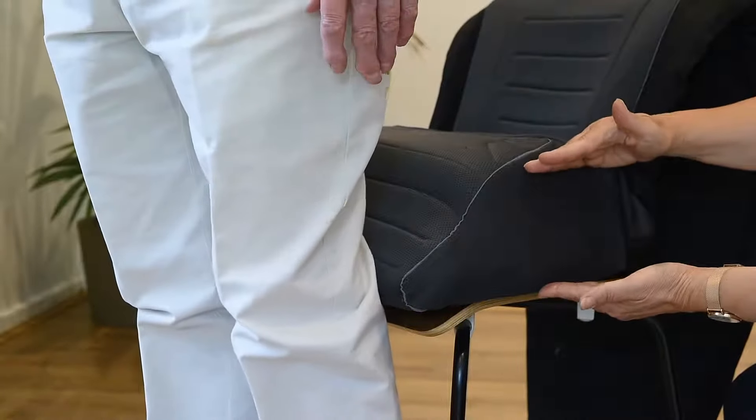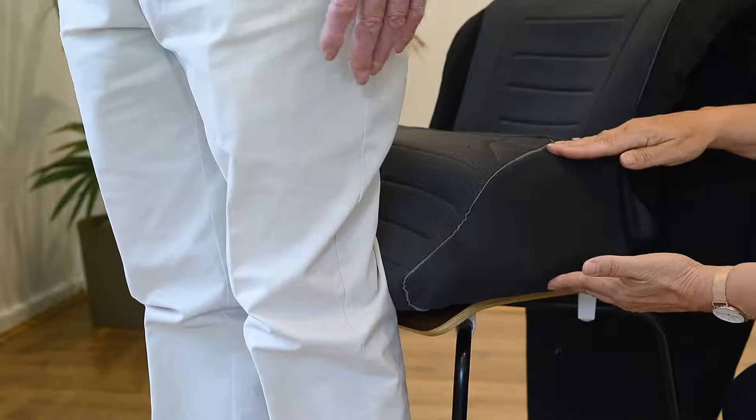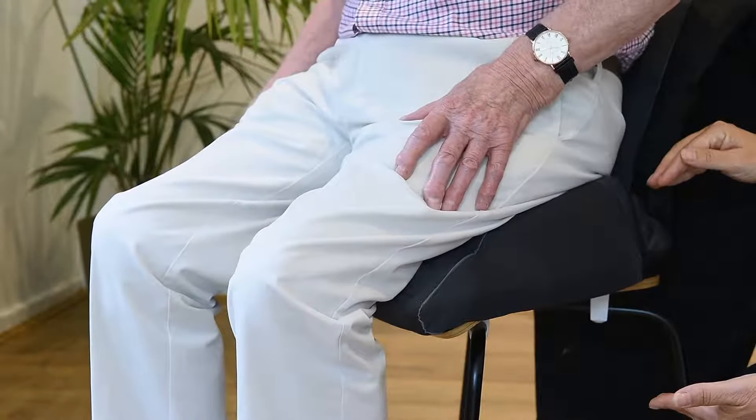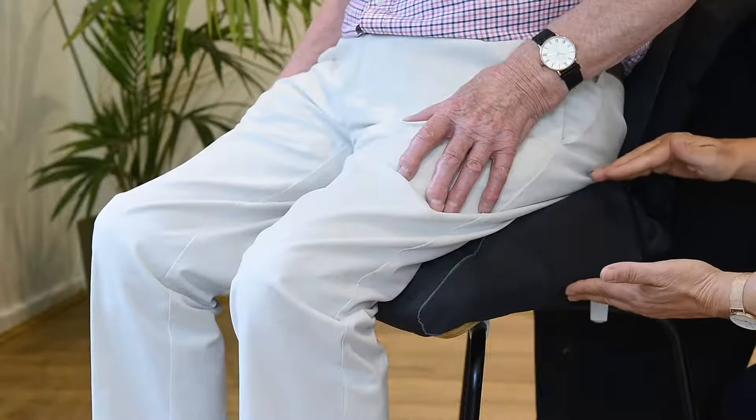Whilst the seat is being deflated, it is firm and cups the gluteal muscles, keeping the client in a good postural position.